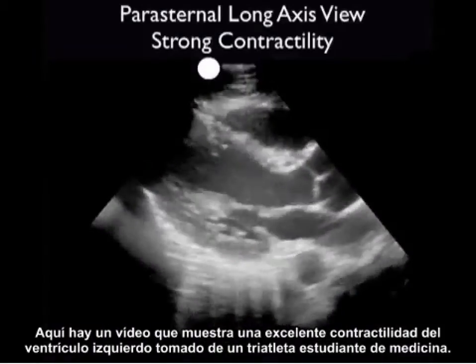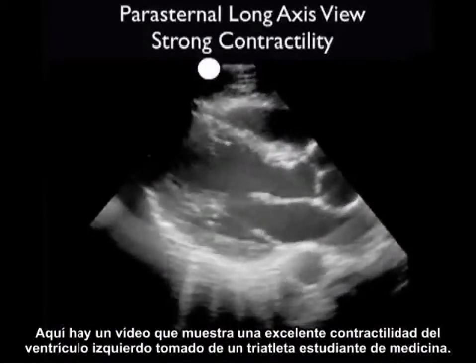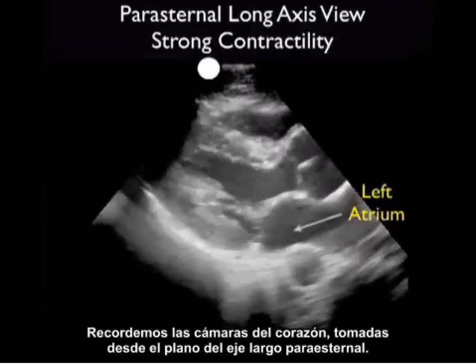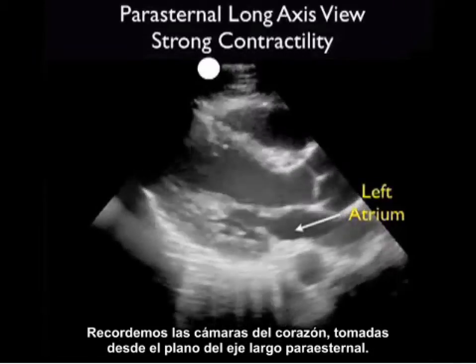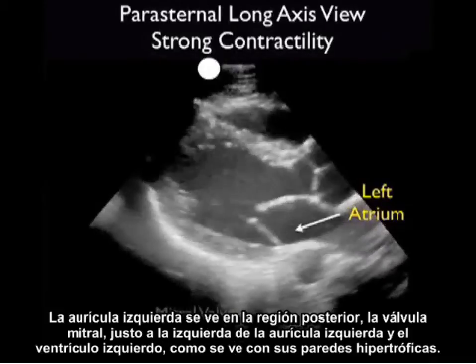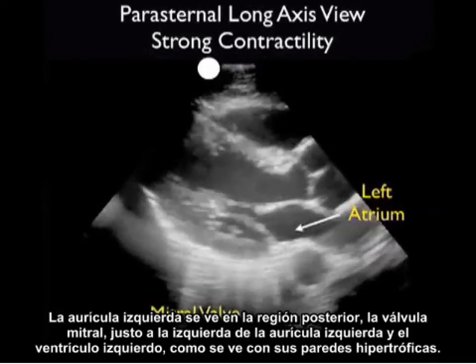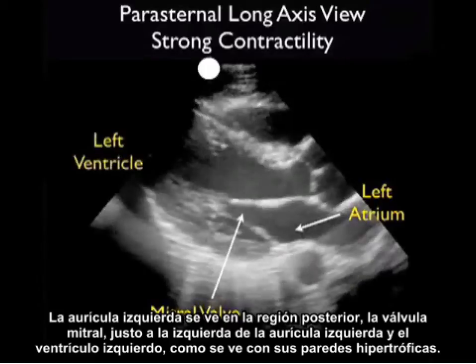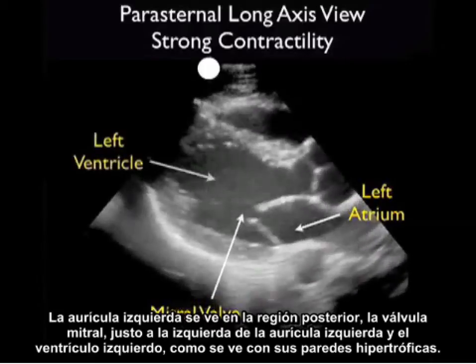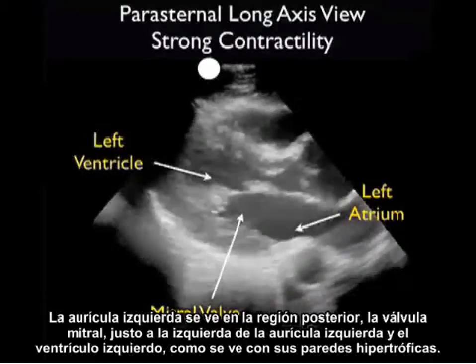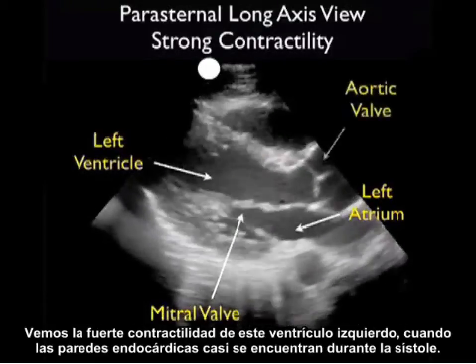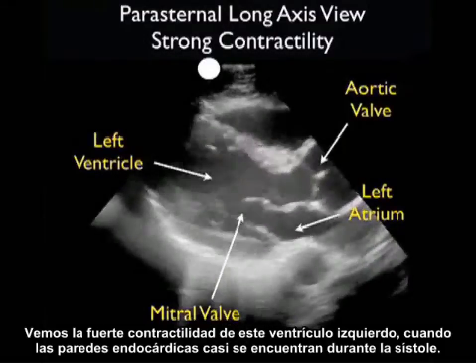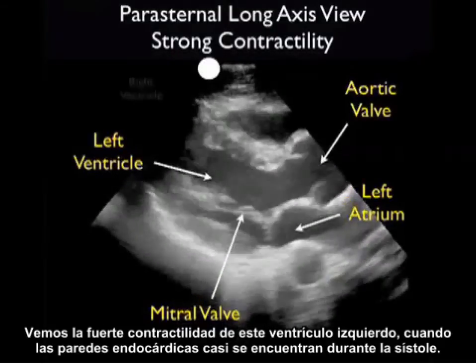Here's a video clip showing excellent contractility of the left ventricle, taken from a medical student triathlete. Recall the chambers of the heart as seen from the parasternal long axis plane: the left atrium in a posterior location, the mitral valve just to the left of the left atrium, and the left ventricle with its hypertrophic walls. Notice the strong contractility of this left ventricle as the endocardial walls almost meet during systole.